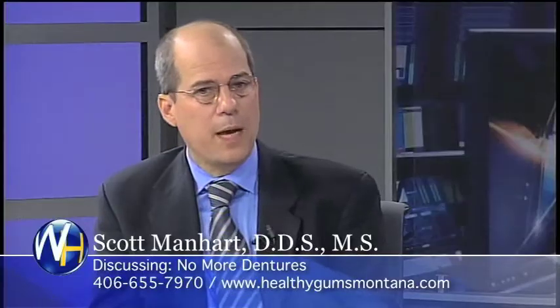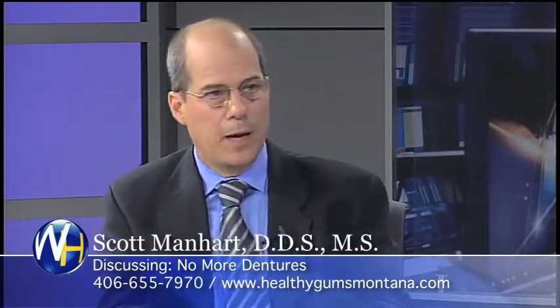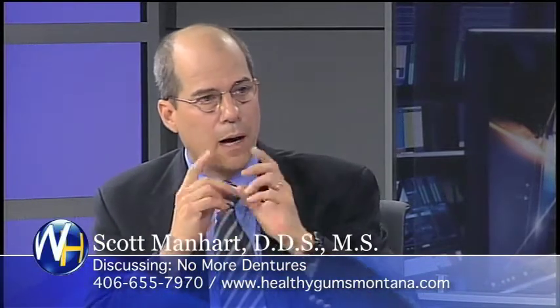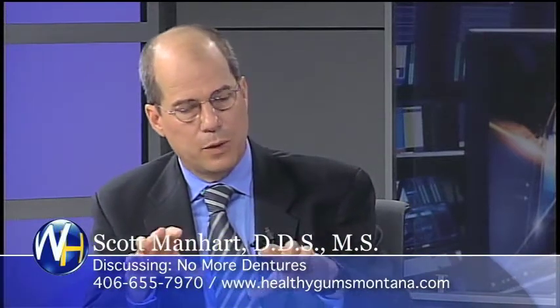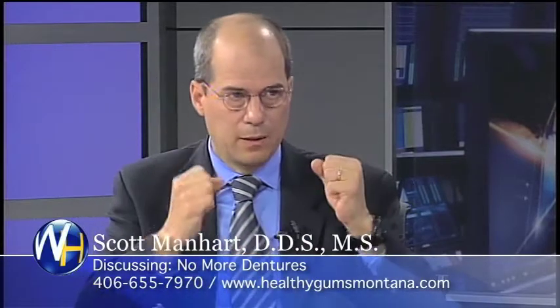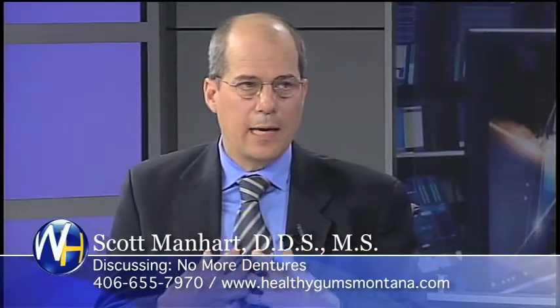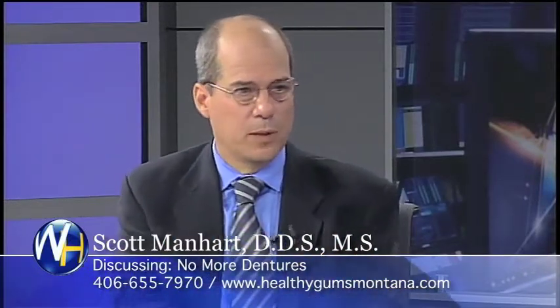The next level up, some patients still want a little bit more stability. They like a 4-legged table. And so we'll add 2 more in a little further back, and this gets rid of some of that rocking. These restorations are extremely well retained. I have patients who come in and literally have to pull hard to get them to disengage and come out. Sometimes I can't do it because the patients have figured out the way to get it on and off, and I just let them do it. And they could eat and chew? And chew anything they want.